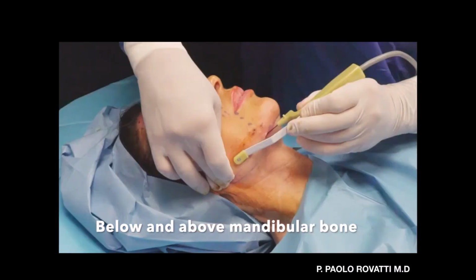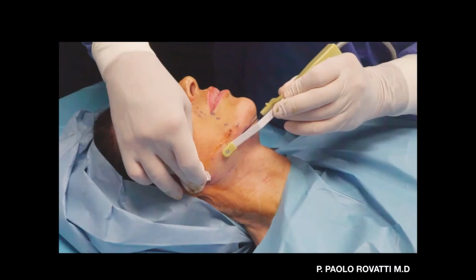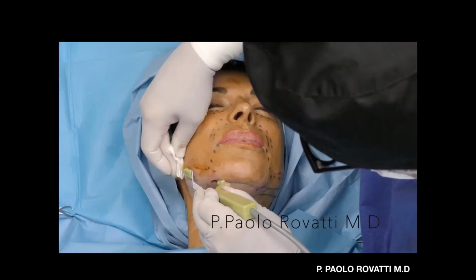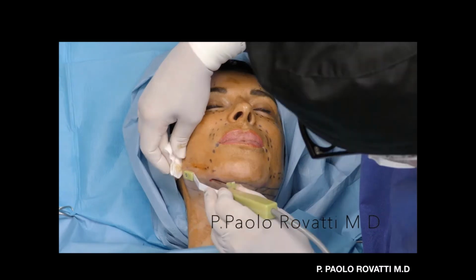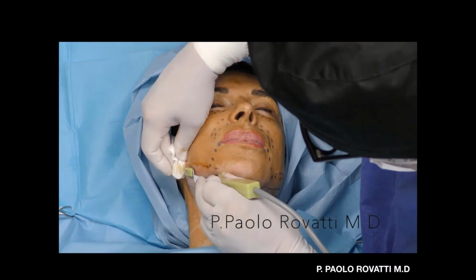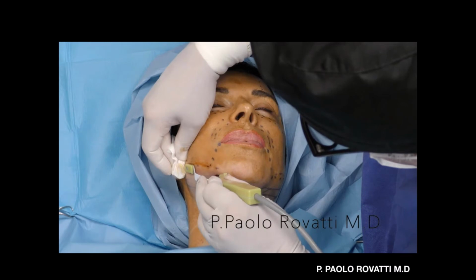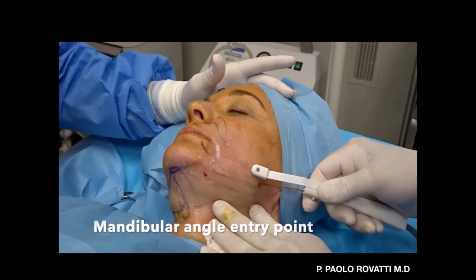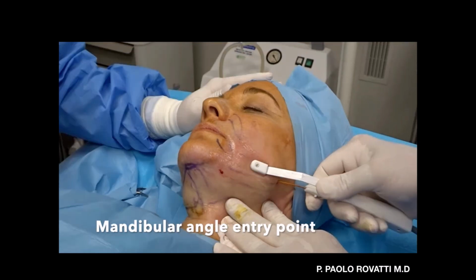Just a little treating area where I want to reduce the fat, and I use the stopping technique or moving backward. It doesn't matter if you're going from this side or from the other side. This is your choice, and it's not important if you go backward from lateral to medial or the opposite, from medial to lateral, because you are doing a fibrosis, a tightening line. This is from the mandibular angle entry point, and I'm respecting the dangerous area, and I'm treating from the other side. So it doesn't matter.